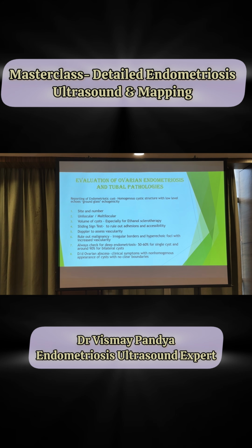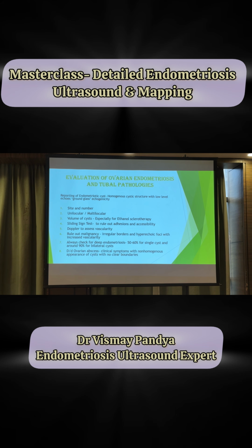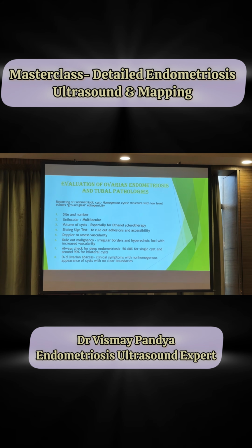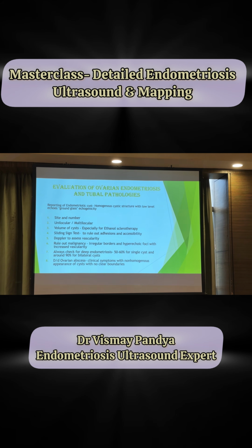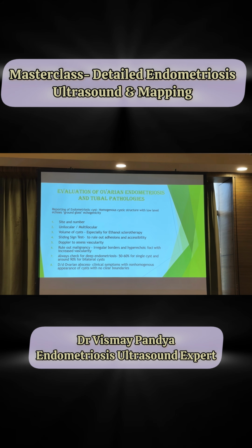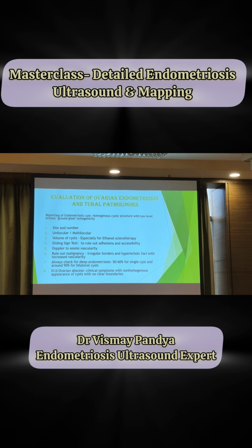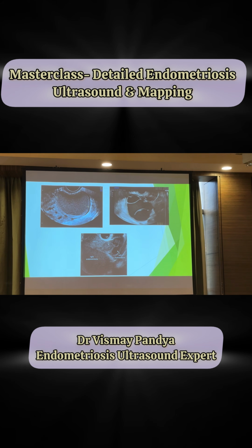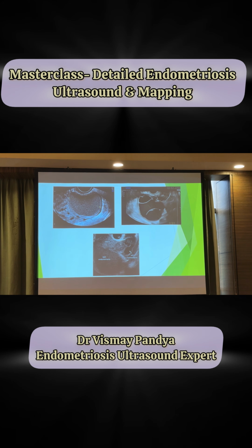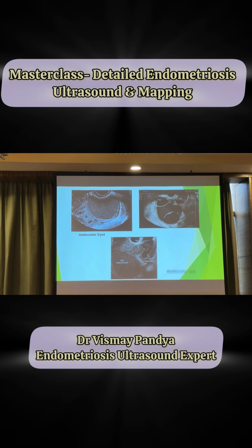We are now having so many patients who have an endometriotic cyst, but during laparoscopy we do see other features of ovarian abscess. Differentiating a cyst from an abscess is very difficult. You have to correlate with the clinical symptoms, if the patient does have fever, and there may be some non-homogeneous appearance of the cyst with no clear boundaries. If you see that, that should be a suspicion for ovarian abscess while doing the surgery. As you can see, it's unilocular, multilocular, and hematosalpinx. Of course, we can see the tubal pathologies, hydrosalpinx and hematosalpinx too.